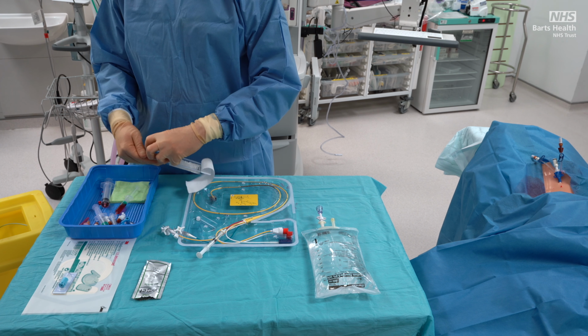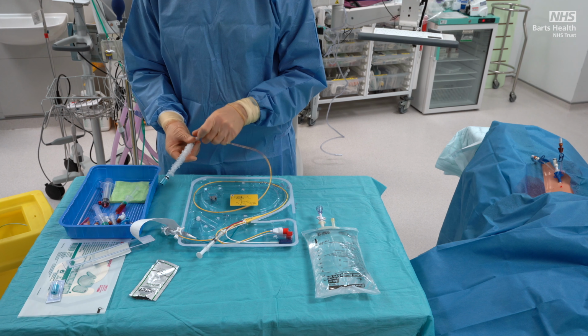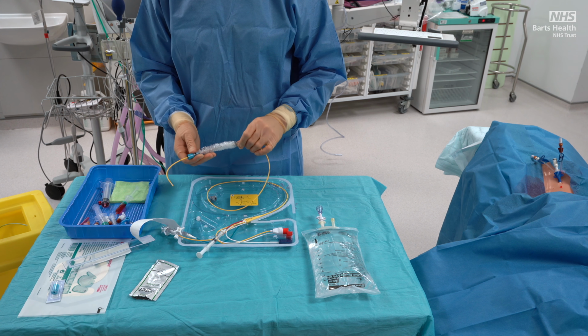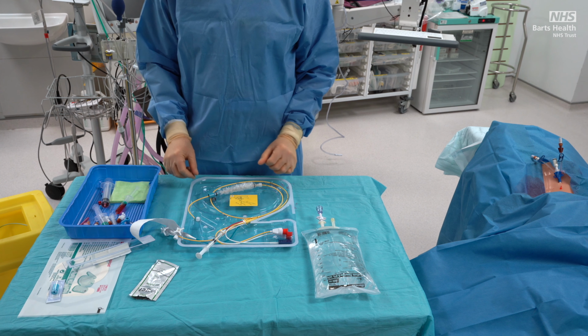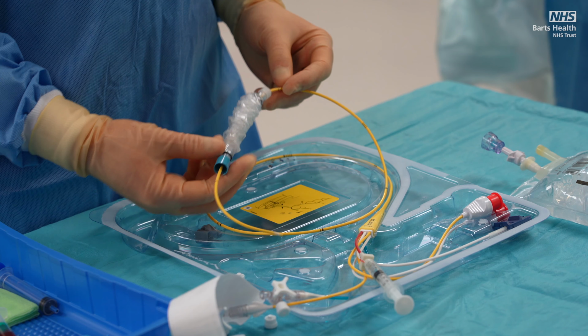Next, insert the catheter through the protective sheath which is included with the introducer sheath, and prepare it so that it will be easy to cover. This involves ensuring that the lock connector is correctly orientated so that it will be able to be placed appropriately on the end of the introducer sheath.